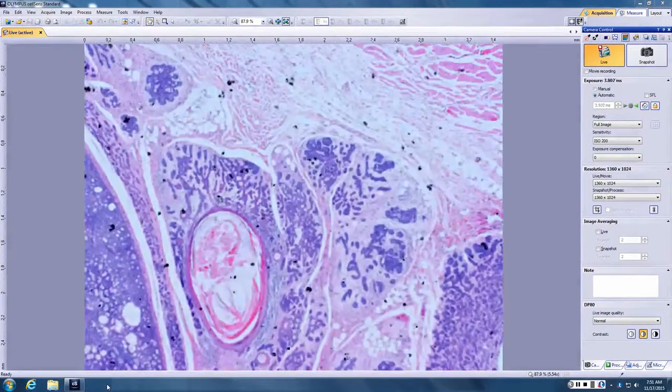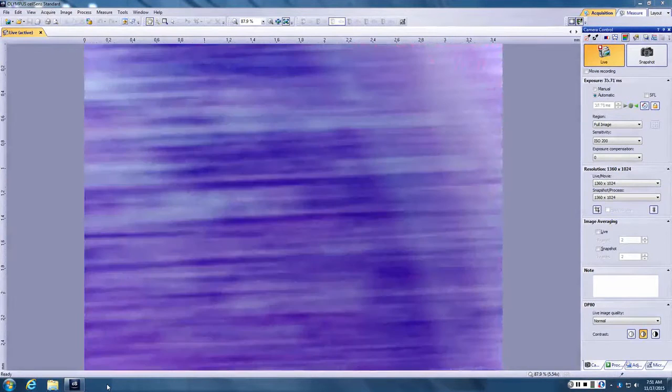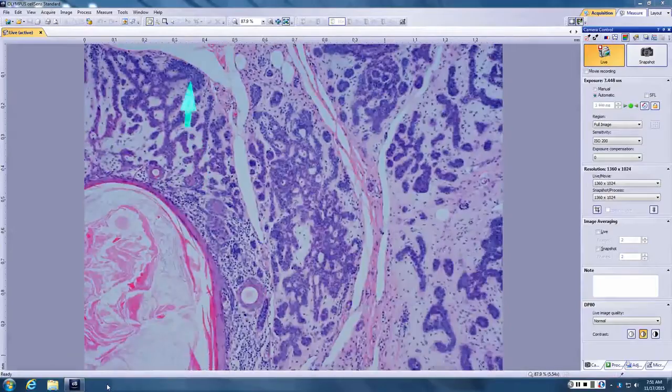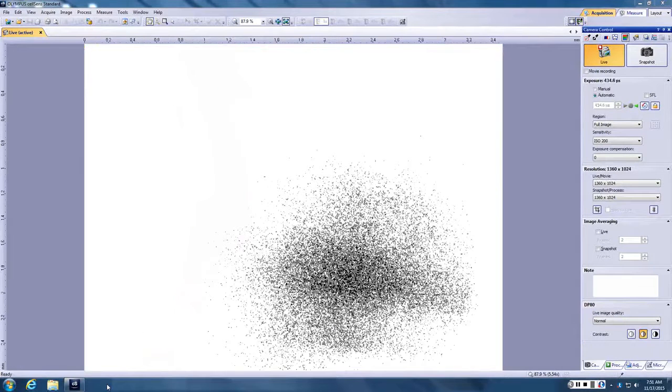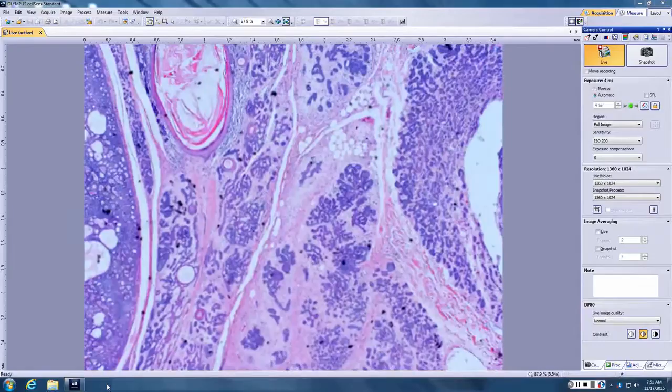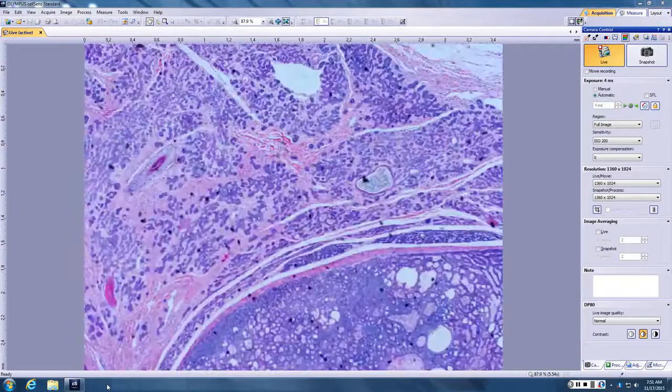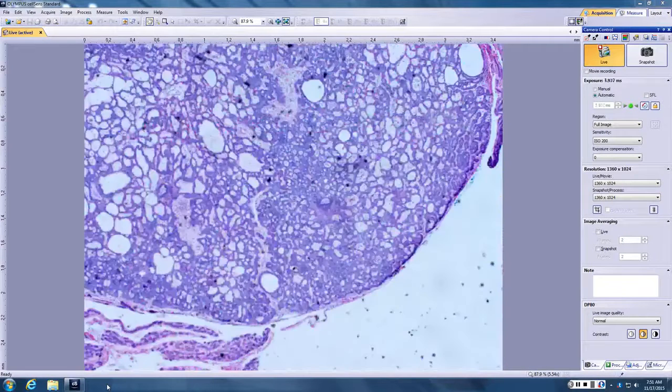And when you look at the color, can you make out the strands are kind of pink, and then the buds are blue? Yeah. So what has pink strands, blue buds, and horn cysts? Like a microcystic... Basal cell. So basal cell can do that, but a type of basal cell, anyone want to jump in? Infundibulocystic BCC. That's absolutely correct.